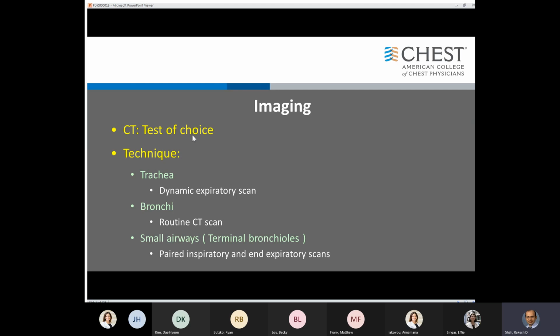If there is anything you can get from this talk today, forget about all the diseases and whatever, it is that you make a conscious effort to look at the area from the very top of the image to the bottom.